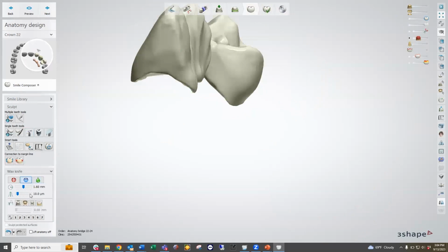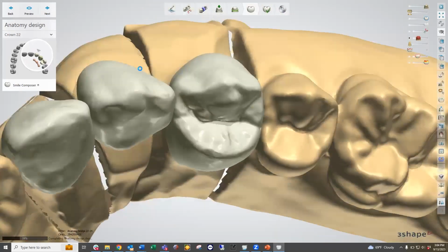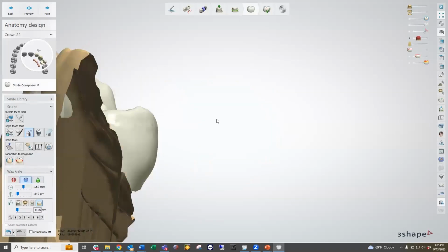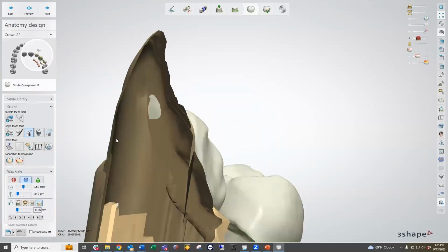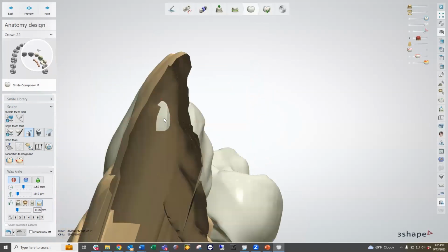We're going to go to the subtraction tool. We're going to go to neighboring teeth undercuts, and we're going to turn on that negative 0.05. Oh, I hit enter again. Sorry, didn't mean to. Okay, so we're going to add where we want to add. If we wanted to make it a little bit more emboldened, we can add. But it's only going to add so much to that contact, okay? And then I'm going to subtract again, just to solidify it a little bit more.